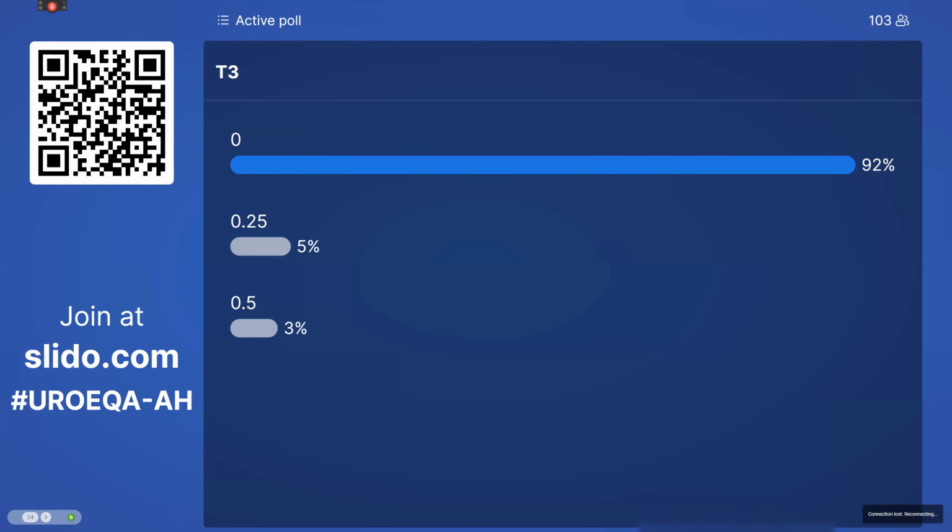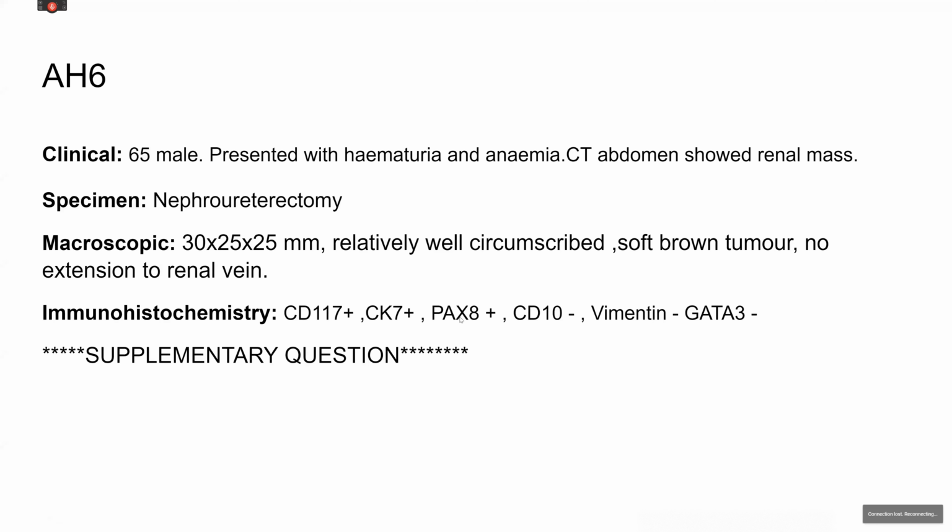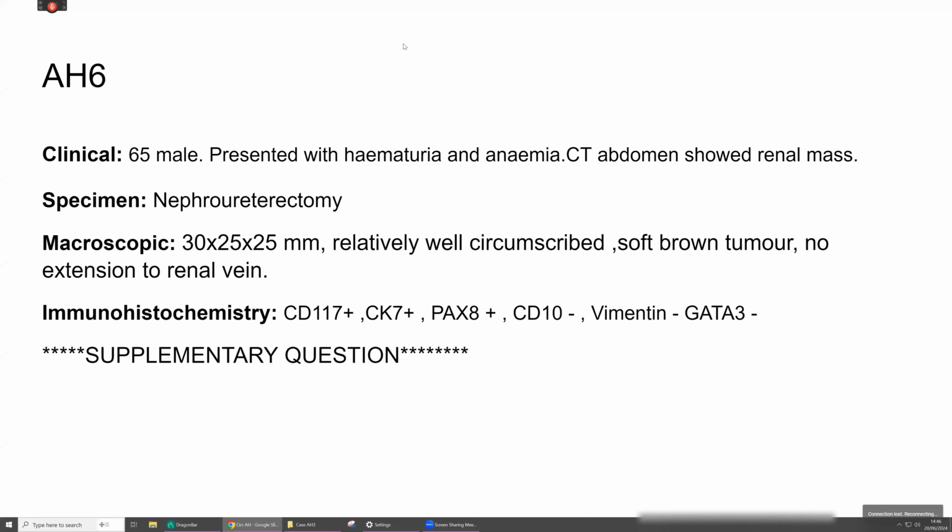Okay. Someone mentioned that muscle invasion makes no difference in this case. And CD56, they find it's a very good marker for lung, and chromogranin doesn't stain much. And small cell carcinoma of urinary bladder is not treated like small cell carcinoma of lung, although it implies poor prognosis and aggressiveness.